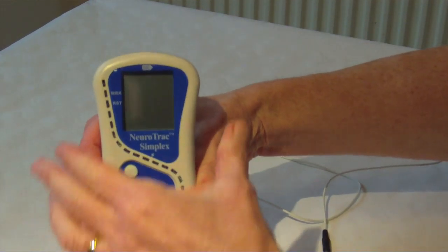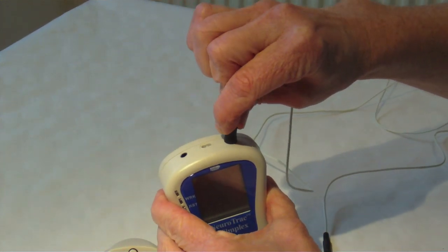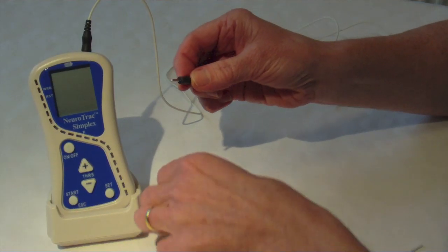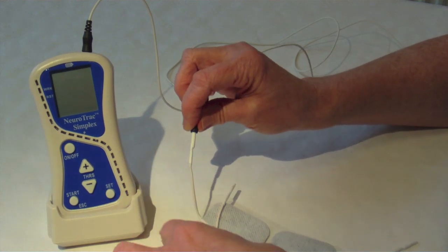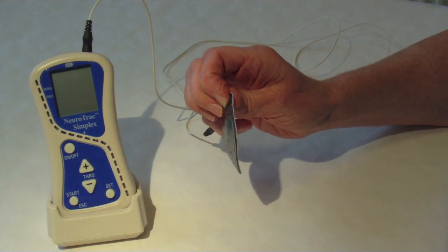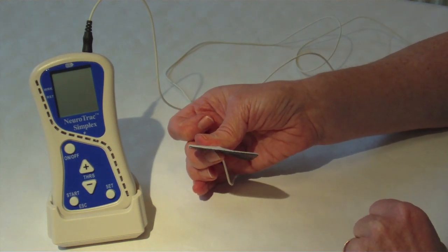To set the unit up, insert the black reference lead into the top right hand socket and attach the end to a surface skin electrode. Place this skin electrode over a bony point such as the side of your knee joint or the front of your pelvic bone. Your biofeedback reading will be much more accurate with this reference electrode in place.